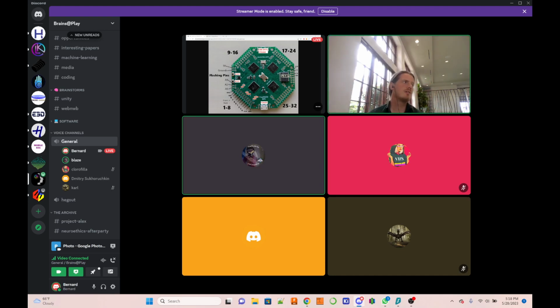This is a simpler setup than I was thinking it was, because I'm used to the Cyton. Yeah, you need more wires, but you have more control in that sense also. If you wanted to, and I think this is possible with Cyton, I'm not sure, but here, you could make every individual channel have a completely different montage, with its negative terminal on a different location.